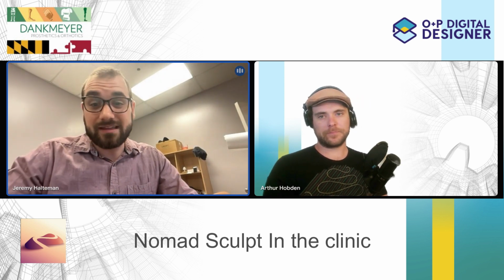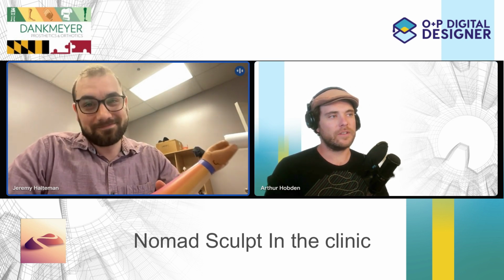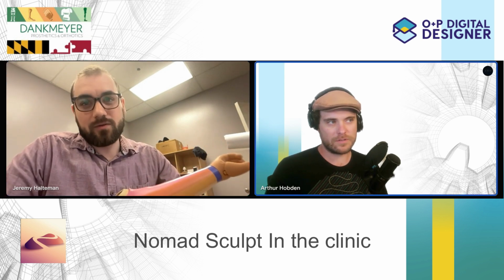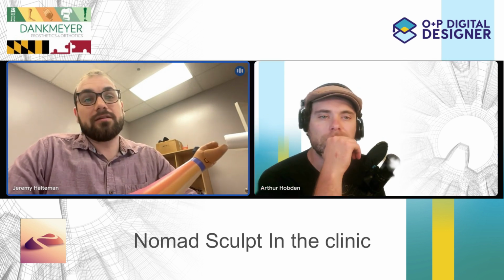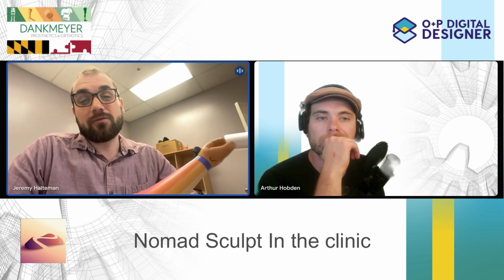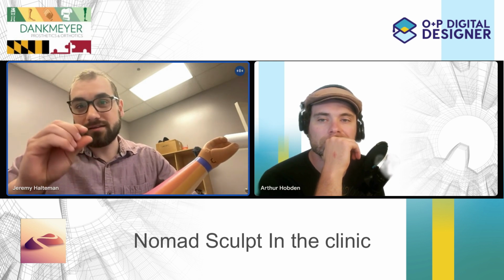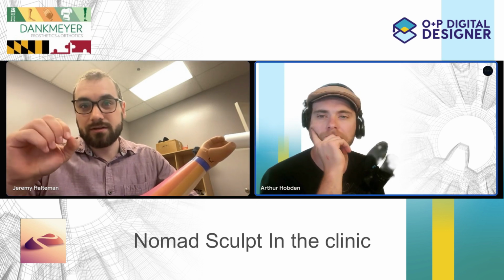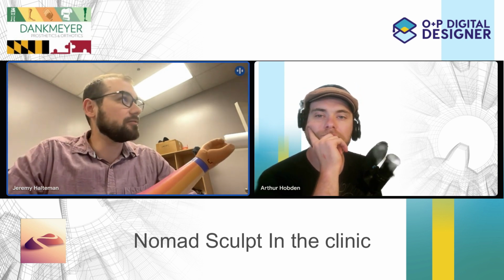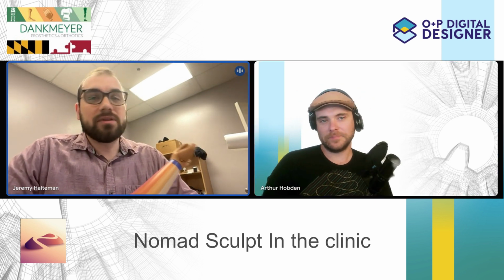It's not great. The other one that we recently ran across that we're still trying to figure out is called Valence 3D. But that is a T-spline editing tool. So you have to leverage that with something like Shaper, between Shaper and the quad meshing from Nomad. So we have quad meshed in Nomad, taken into Valence, and then you can edit the strings, or edit the individual quad meshes. I'm not sure how it handles that. I don't know if it keeps it a quad mesh or turns it into a parasolid spline, probably.